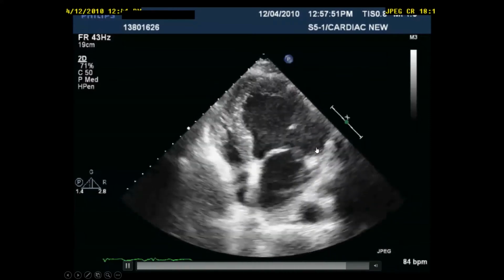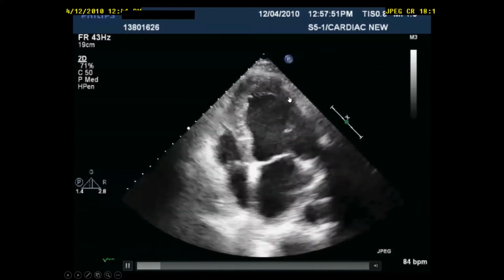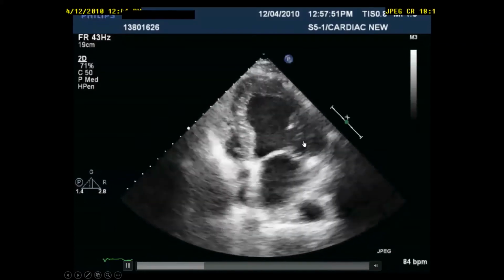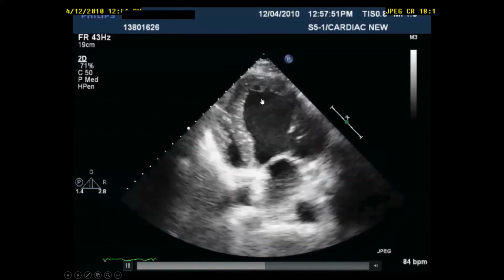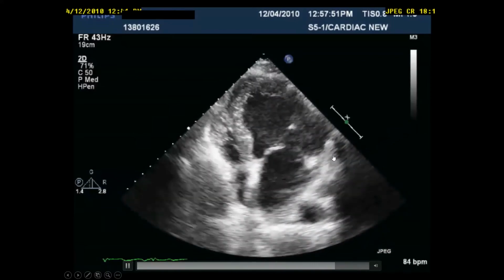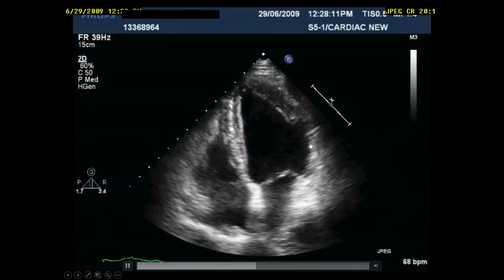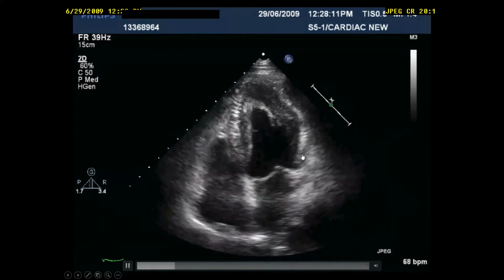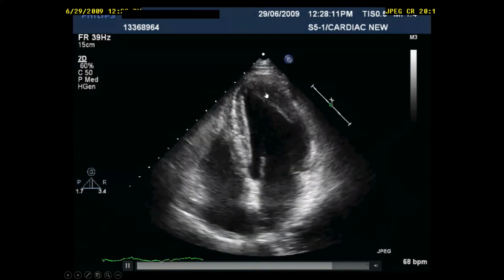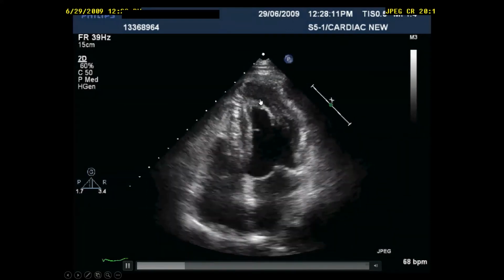The lateral wall. Yes, so this is akinetic lateral wall. The lateral wall is akinetic. And the lateral wall belongs to which artery? LCX. Okay. Sir, could be the diagonal sometimes. Yes, okay, good. Now, again, this is apical four-chamber, and when you see here the lateral wall is akinetic, and if you track it down to the apex, you will see that there is some bulging here in the apex, which needs to be focused on.